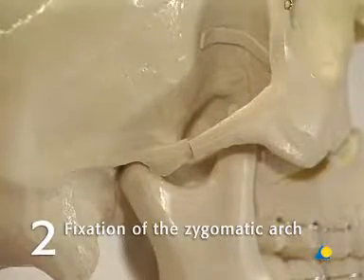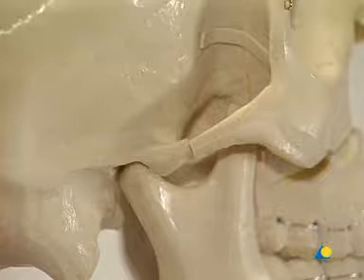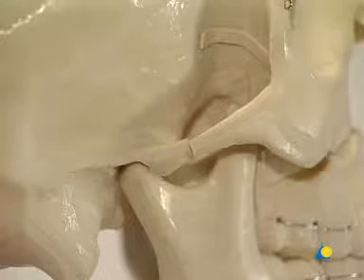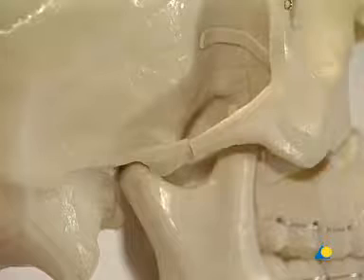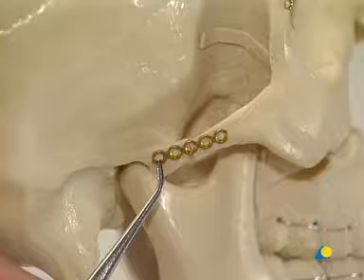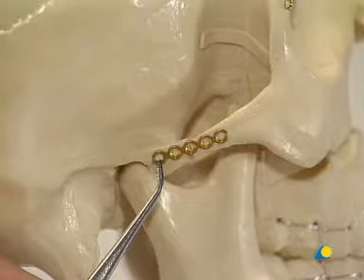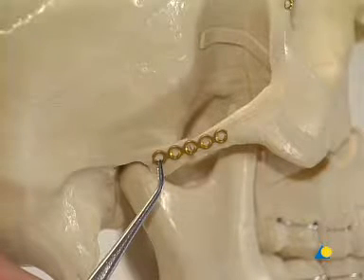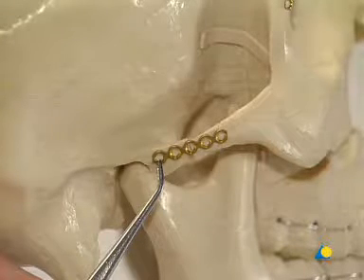Fixation of the zygomatic arch. The next step is fixation of the zygomatic arch, which is essential to establish the correct anterior-posterior projection and the width of the face. A straight five-hole 1.5 adaption plate is used for this simple fracture. However, the zygomatic arch is often comminuted, which would require a longer plate. Due to the anatomical form of the arch, pre-bending of the plate is usually not necessary.